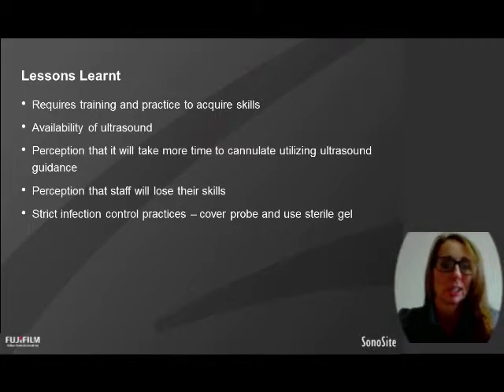A really good option is patients on dialysis with a central line who have a fistula that's maturing. You put them on their dialysis, and then in that downtime you can go over while they're on dialysis and scan their arm and not have them waiting.